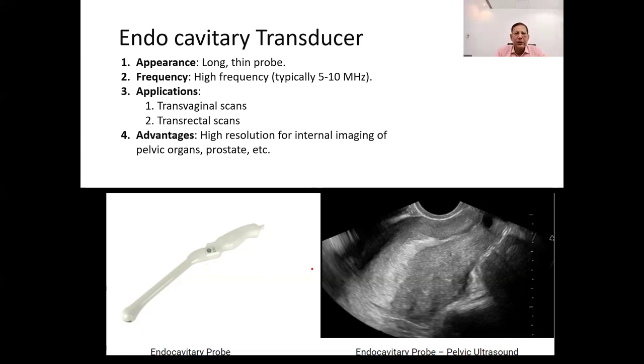The most common applications for the endocavitary ultrasound probe are transvaginal applications in detecting early pregnancy, ovarian torsion, ovarian cyst, fibroids, ectopic pregnancy, etc. Make sure to always place a sterile cover, such as a condom or glove, on the endocavitary probe prior to scanning.